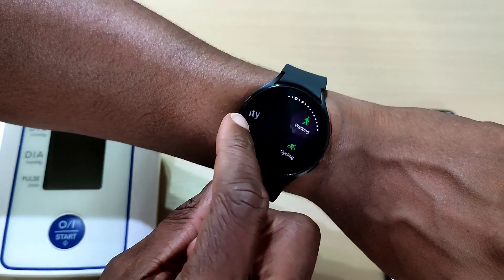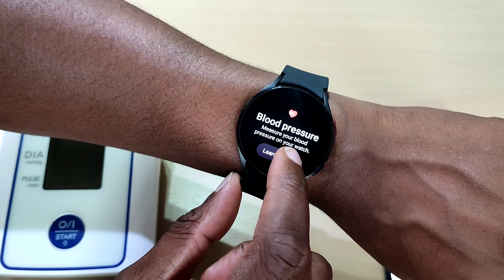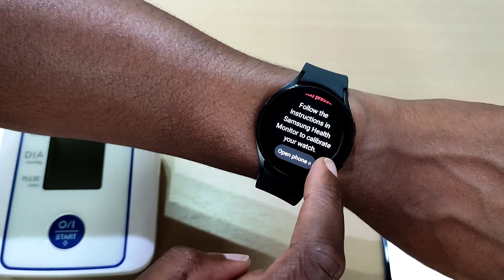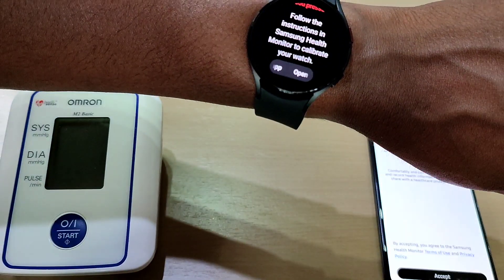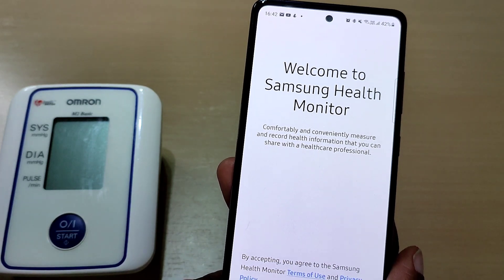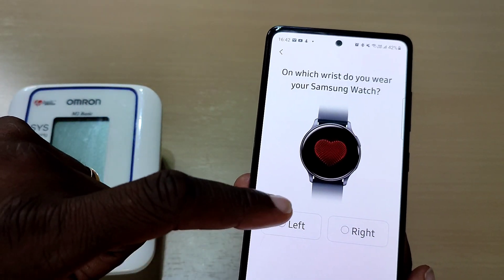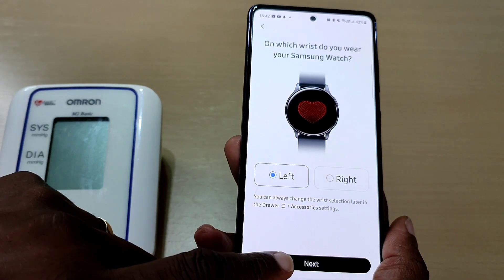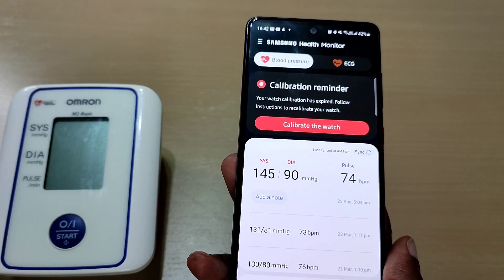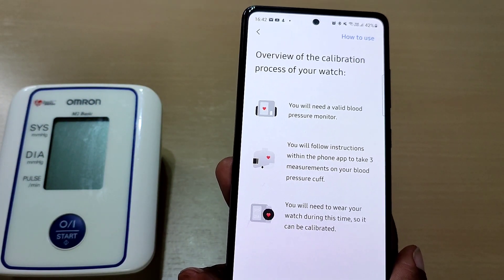Let's check the blood pressure. It says follow instructions in Samsung Health Monitor to calibrate the watch. Welcome to Samsung Health Monitor — press Accept. Which wrist do you wear your Samsung watch? Left wrist. Click on Next. We need to calibrate the watch, so let's do that.